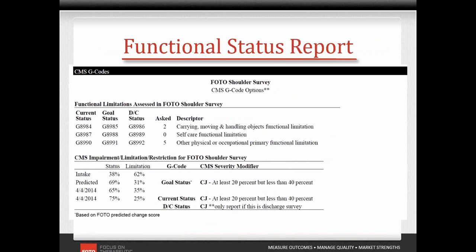At any point, a status update may be completed by the patient. This adds the patient's current status or discharge status severity modifier to the report, depending on where the patient is in the treatment episode.